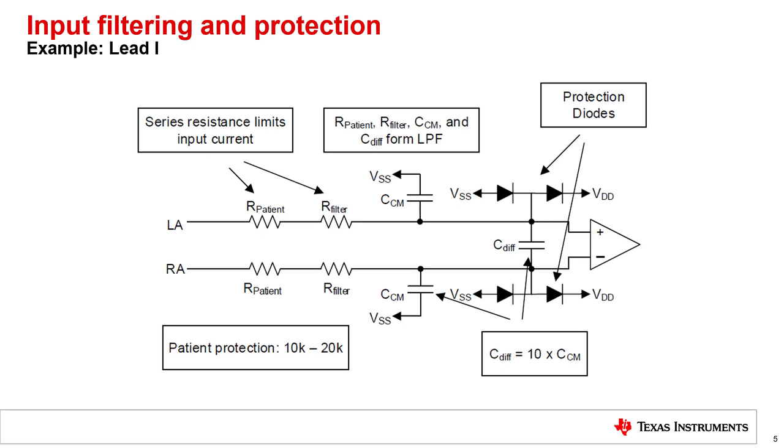We still need the common mode capacitors to filter out high-frequency common mode signals, but it should not be the bulk of the filtering, otherwise the component tolerances can degrade our CMR. We'll talk about CMR in more depth when we discuss the right leg drive amplifier. And finally, number three, we need a diode circuit to protect against defibrillator shocks. A defibrillator can deliver voltages in the kilovolt range to help the patient restore normal heart rhythm. When properly designed, the diodes will clamp the input voltage to within the absolute maximum input voltage of the INA, and the resistors will limit the current that flows through the diodes.